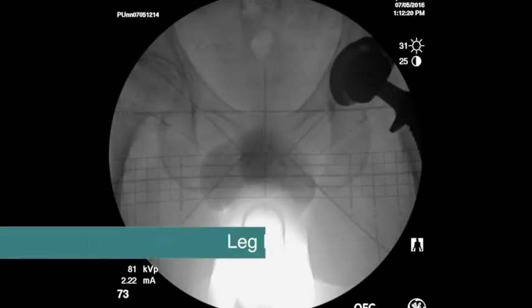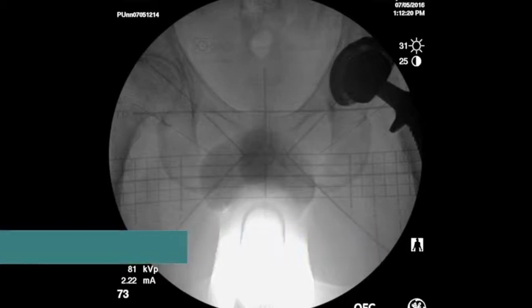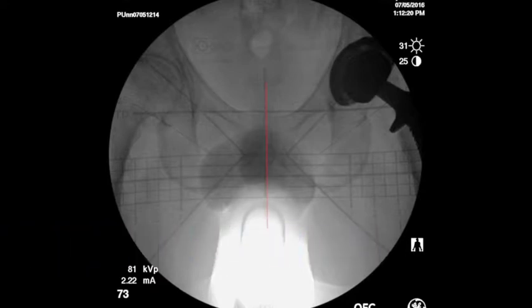And then here is our final check for our limb lengths and offset. When we look at this image, we can see that the coccyx lines up with the center of the symphysis for rotation. We can see that the grid is lined up with the center of the symphysis. Looking at boxes away from this vertical dark line, I'm just shy of 2 boxes from the edge of the ischium on this operative side, and just shy of 2 boxes from the edge of the ischium on this non-operative side. So my rotation is correct in terms of roll side to side.